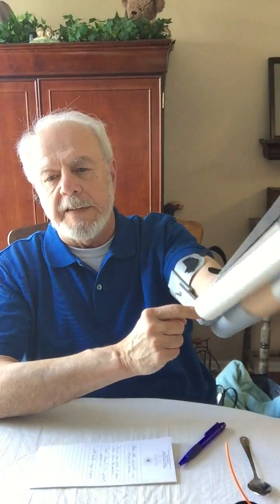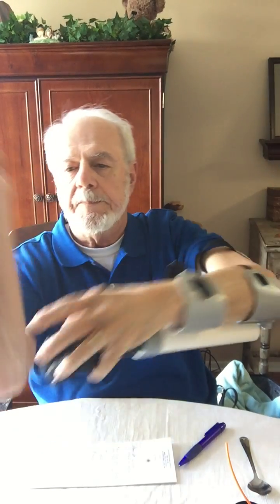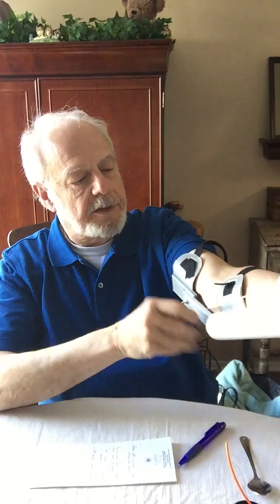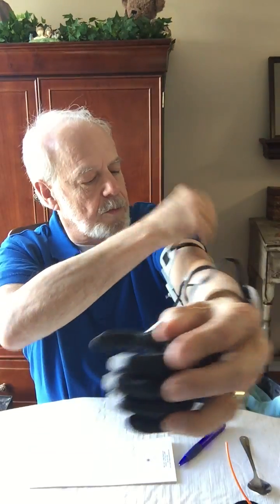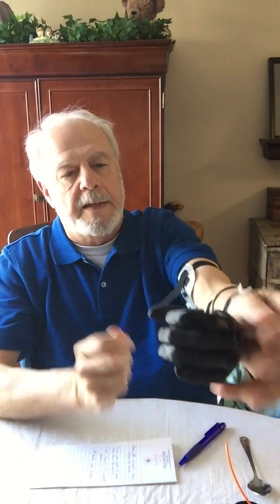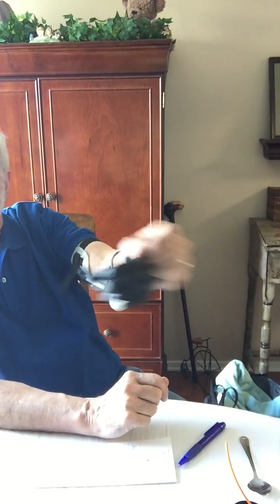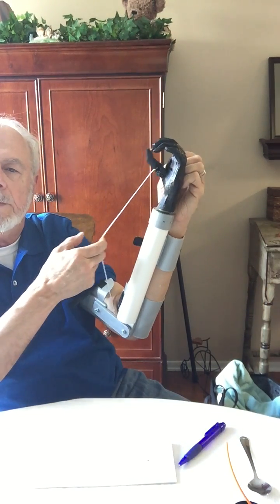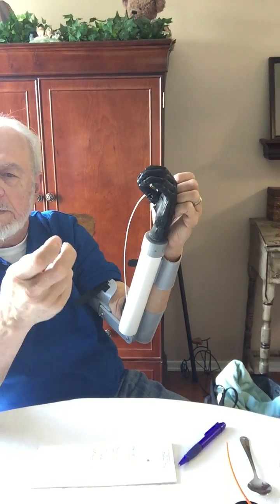Now, one critical thing is to get the hinge right on the hinge of the elbow. There's a little bump on your elbow that you may be able to feel with your other hand. This is called the epicondyle, and it's sort of a good locator for where the hinge point is. So you get that hinge on your epicondyle, and you can just start strapping it on with Velcro straps. And this allows the terminal device to work on a Bowden cable in much the same way that a split hook works on a traditional prosthesis.